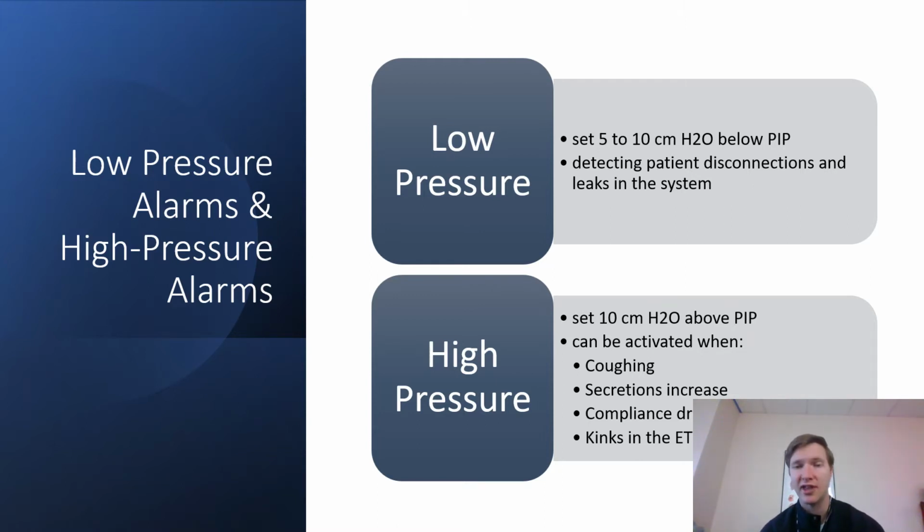Not all patients are like that, but most will be. So it will help in detecting patient disconnections and even leaks in the system. So that's something to be very, very cognizant of when we're looking at it.